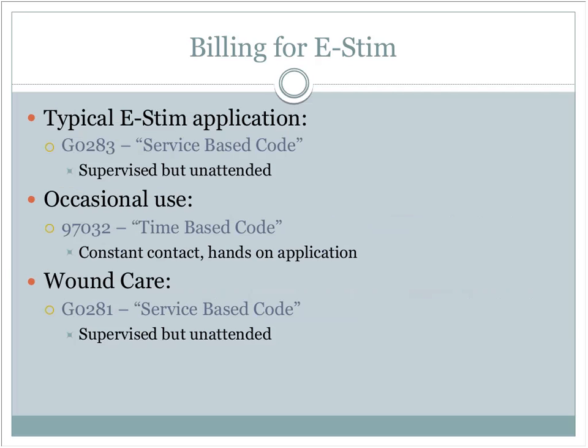Now, you can put them in the gym in the corner while it's running while you're treating another patient, absolutely. And for that other patient, that's one-on-one treatment time because we're not billing for the time it's running. So we're not double billing on that, okay? But that's supervised but unattended, meaning you're not hands-on.